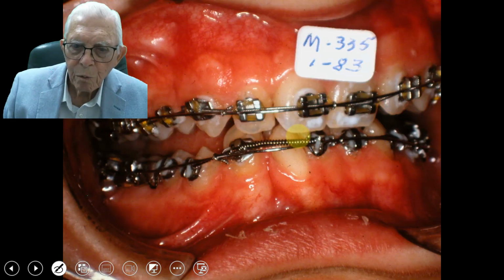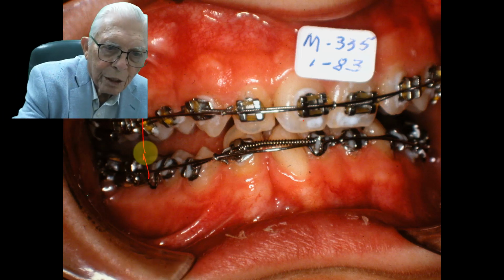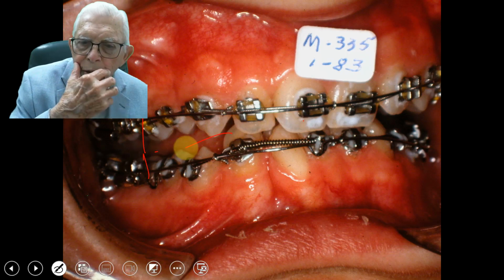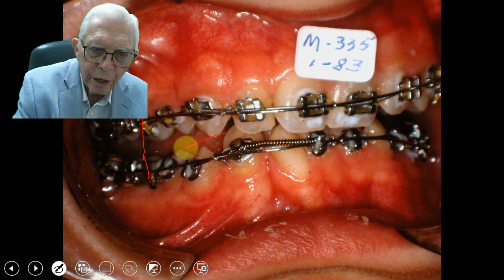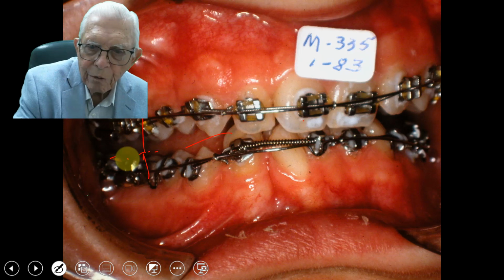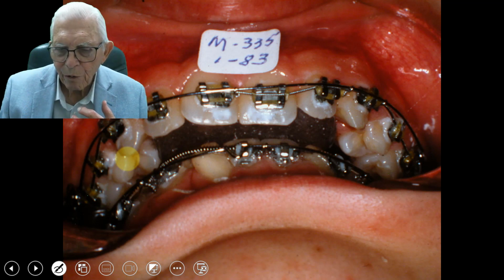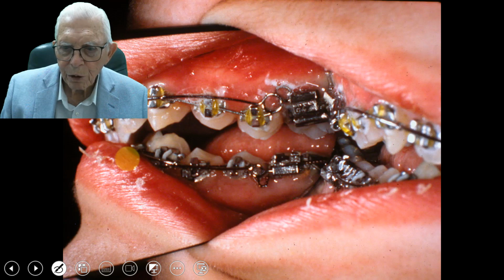This is a little more complicated case, but now we are going to open this up. We'll pull these teeth together back here, and when I do, this is going to give him a little more vertical height of the face. If I didn't want that, I'd have to put some blocks in here for him to chew on. So here we go. Now we built a bite plate that would force him to bring his jaw out. And I'll show that here in another picture or so.